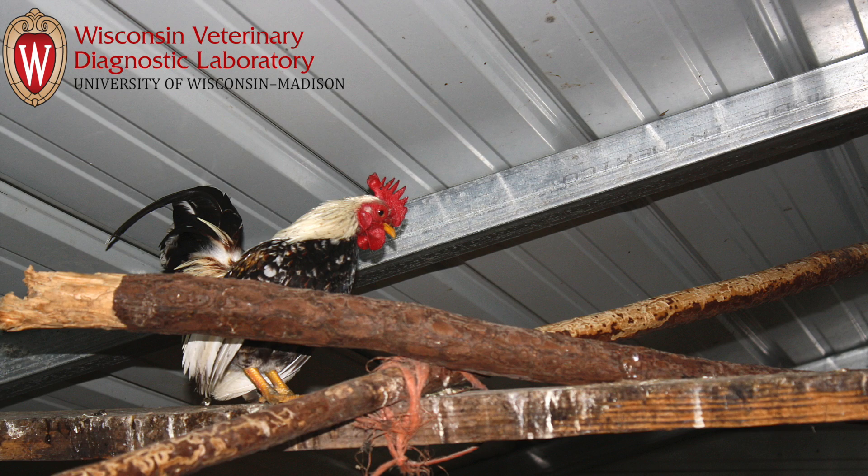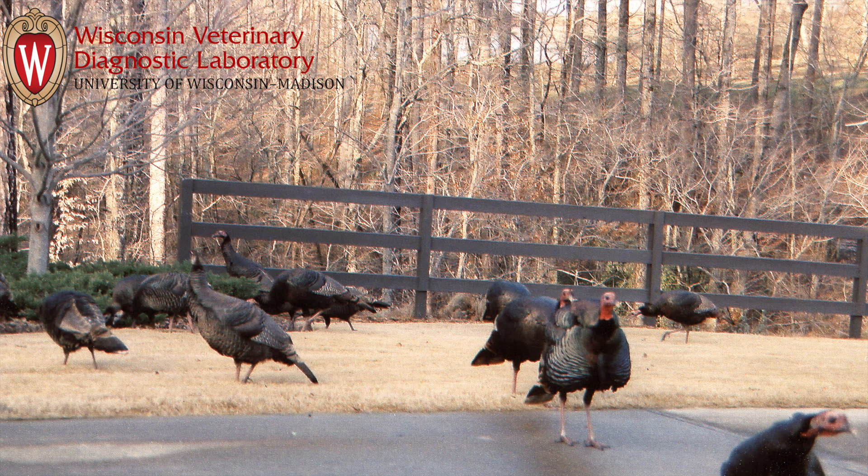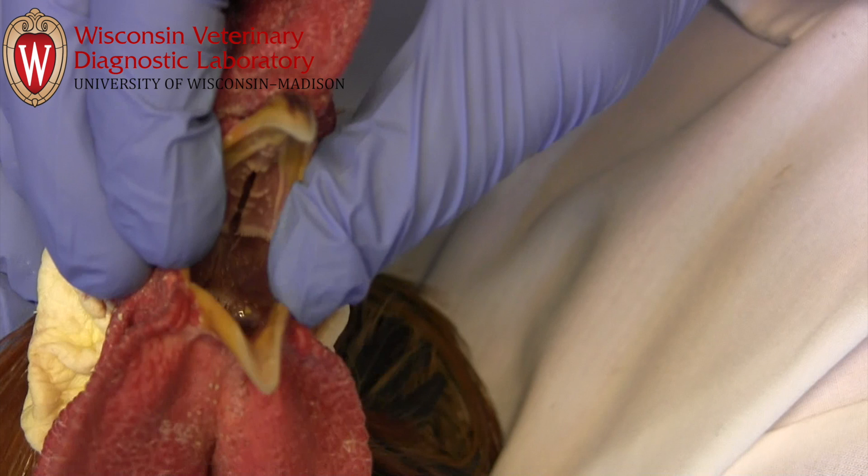For poultry and other gallinaceous birds, including game birds, the appropriate sample is a swab of the oropharynx, particularly the choanal slit.